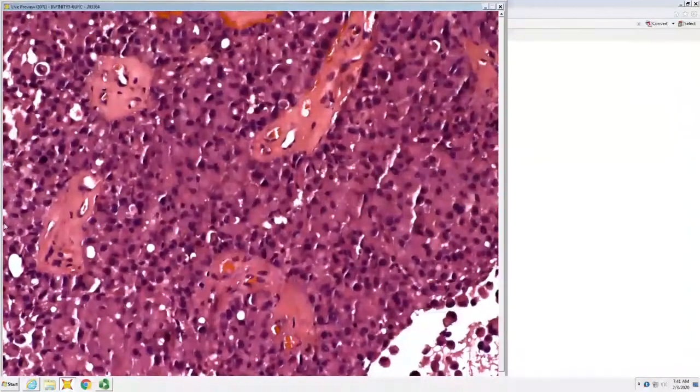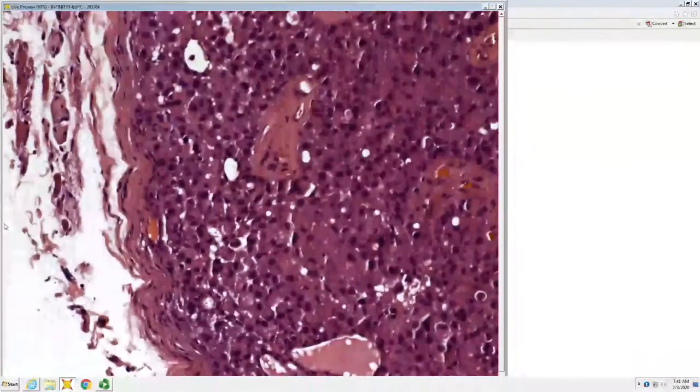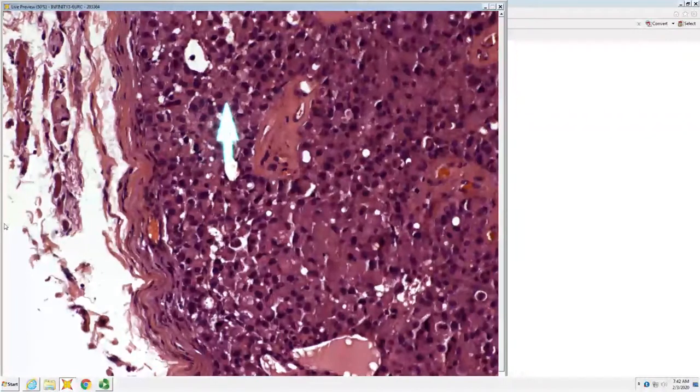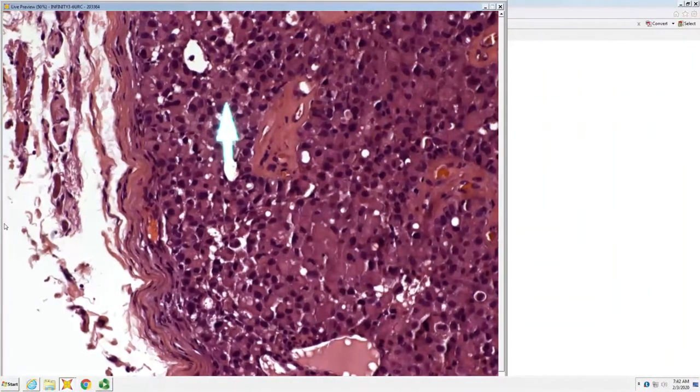So this kind of resembles rhabdoid cells, except that many of the nuclei are central and you have a bright red granular cytoplasm. Those are what are called oncocytes. Do you know any cutaneous syndrome where you get renal oncocytomas? Birt-Hogg-Dubé. I didn't know that. Right? So you memorize that word, oncocytoma, with Birt-Hogg-Dubé. What does it mean? It's a renal cancer that has central nuclei and these bright red granular cells.